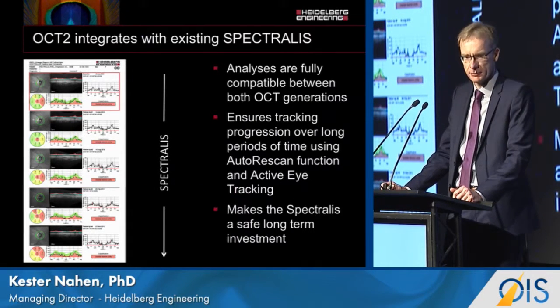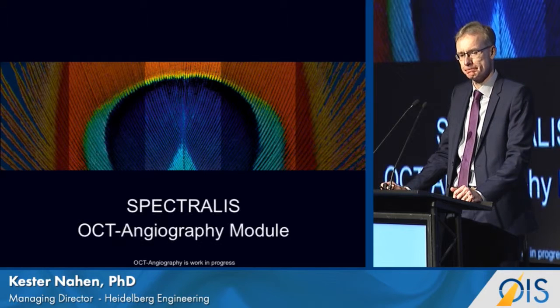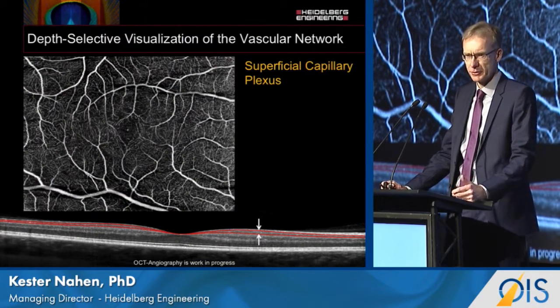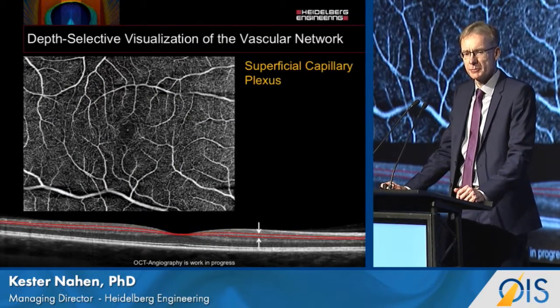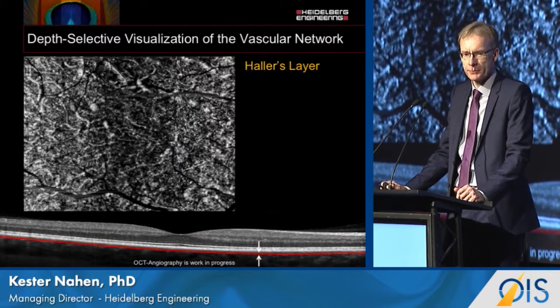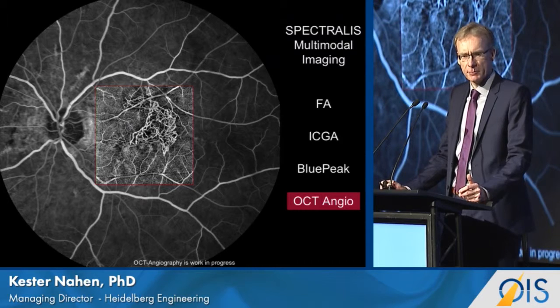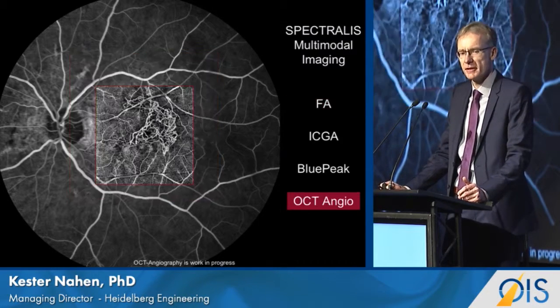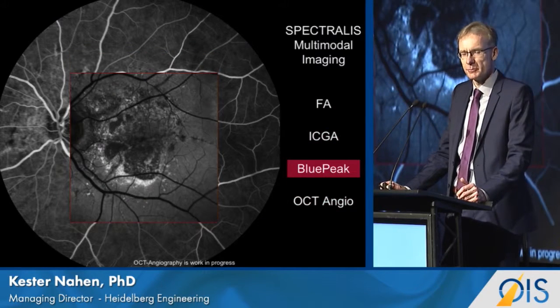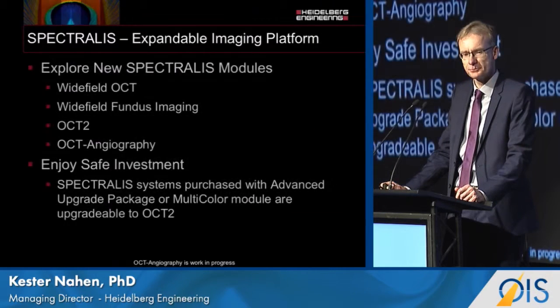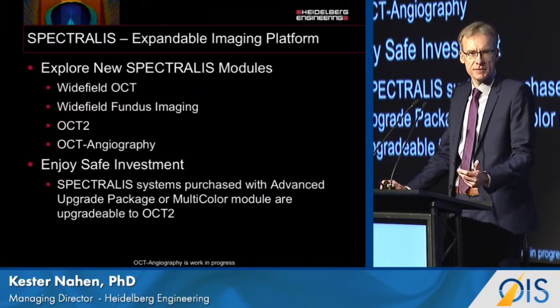This makes Spectralis a very safe investment, as you can have patients imaged on both platforms and look at progression series over time. The OCT2 module is also the foundation for OCT angiography. Here we are looking at the vascular network — the profuse nasal network from the superficial plexus, the deep plexus, all the way down to the choriocapillaris and the choroid. As a multimodal imaging platform, OCT angiography fully integrates with fluorescein and ICG angiography.